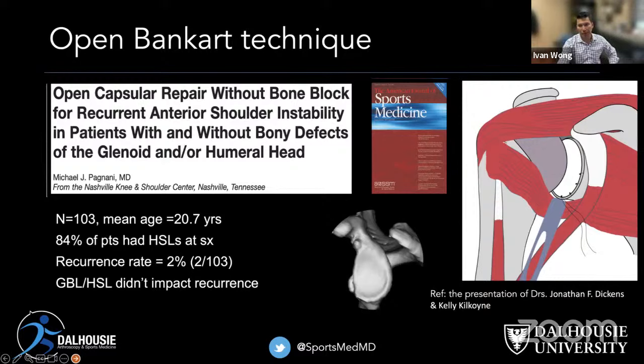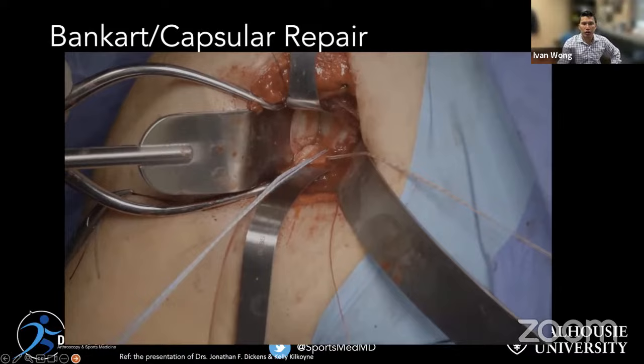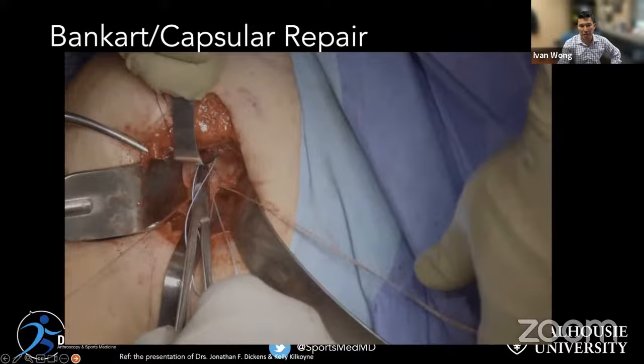The key difference with the open approach is the deltopectoral interval release. Going lateral to the coracoid, you really can get into the joint. You do damage the subscap, and that's really why arthroscopic reconstructions are beneficial. Courtesy of our American colleagues, Dr. Dickens and Dr. Kilcoyne, this open view shows the amount of shift possible — they take the glenohumeral ligaments from inferior and physically shift them from inferior to superior, and this is what we want to replicate arthroscopically.